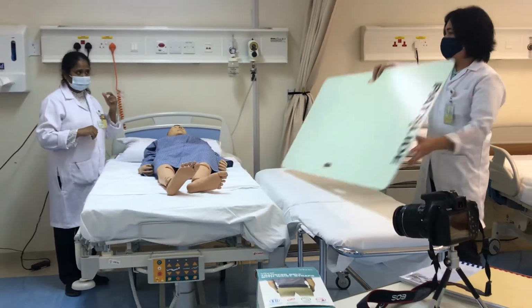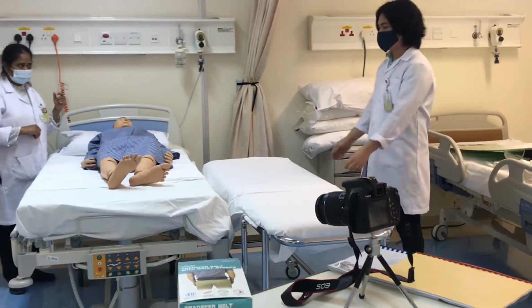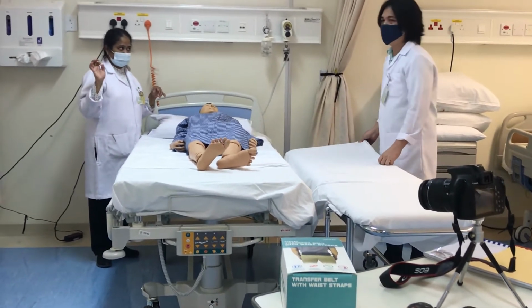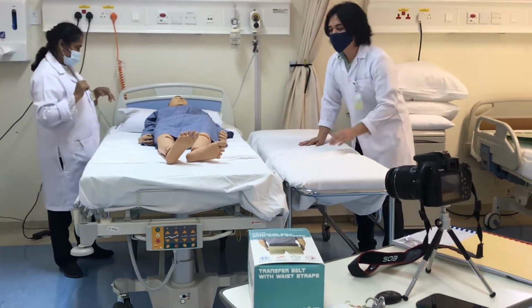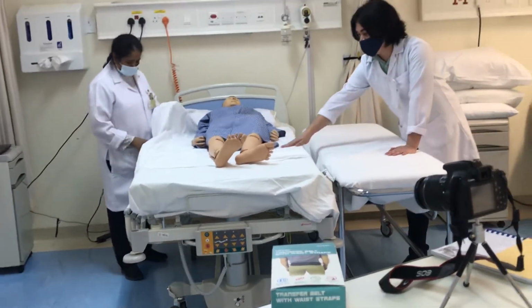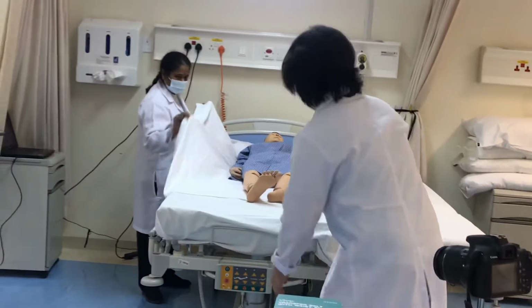We will first use the turn sheet before this one. Okay, now I'm going to elevate the bed higher than the stretcher because I'm going to move the patient to here. This is higher already.